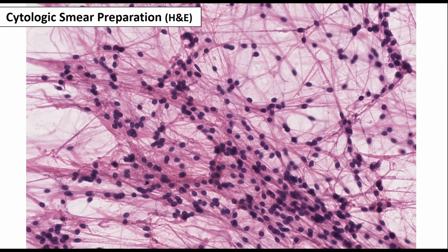Infratentorially, you could have said this is a fourth ventricular tumor. What I would have liked even better, because all ependymomas in the posterior fossa are in the ventricle, is a fourth ventricular mass that is growing out through the lateral foramina of Luschka and plus or minus the median foramen of Magendie. Or if you're in Texas, Magendie. Magendie, yeah, okay, right? That's plastic ependymoma, highly characteristic.